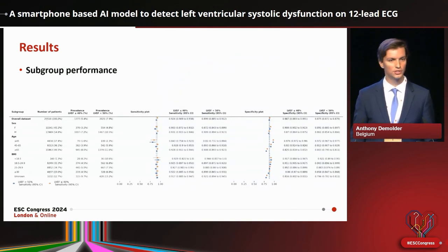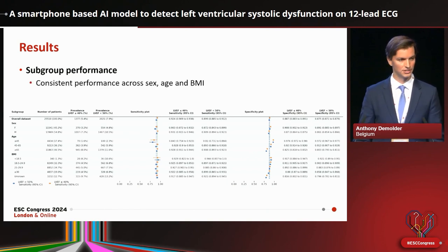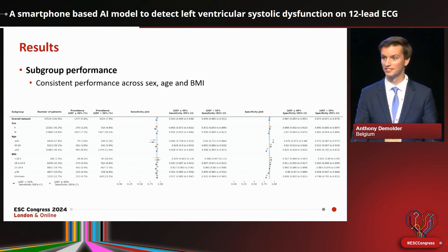And now next, we also looked into subgroup analysis. We saw that if we look at the demographics of these patients, there was consistent performance of the AI model across age, sex, and BMI.